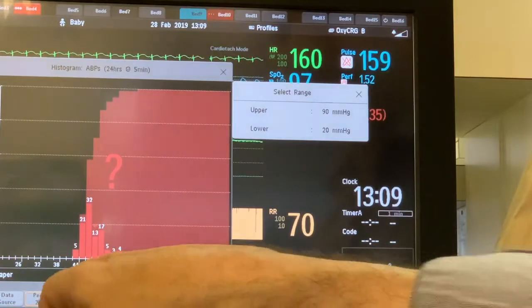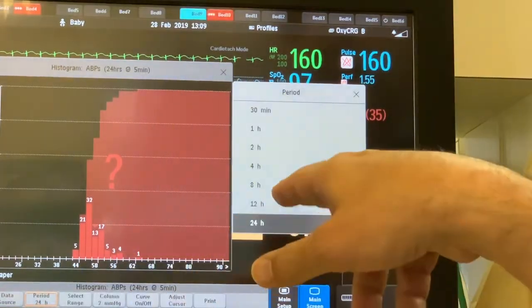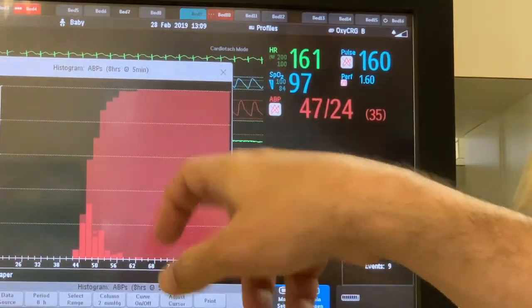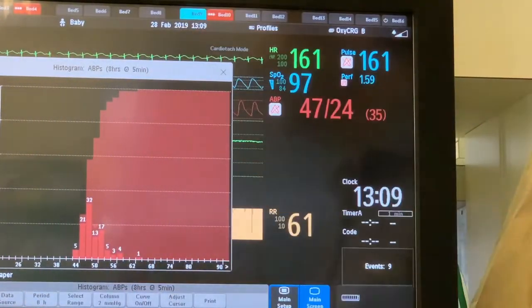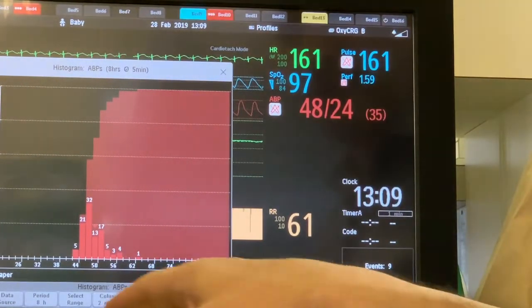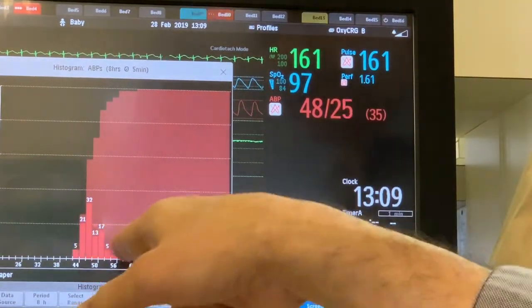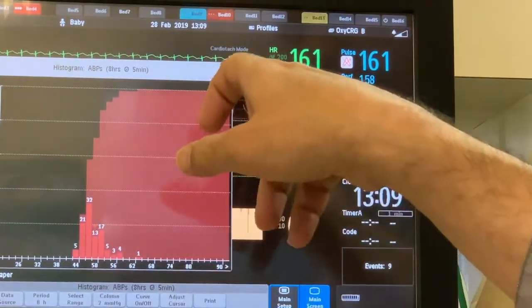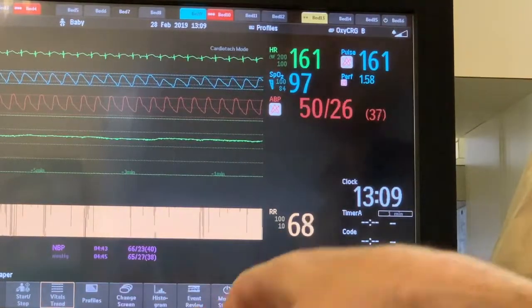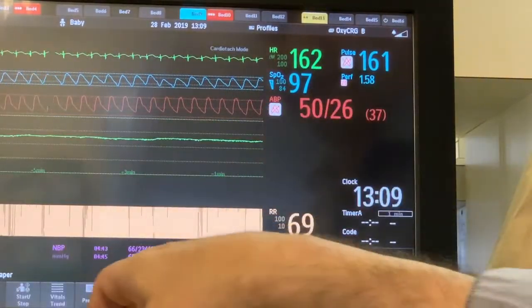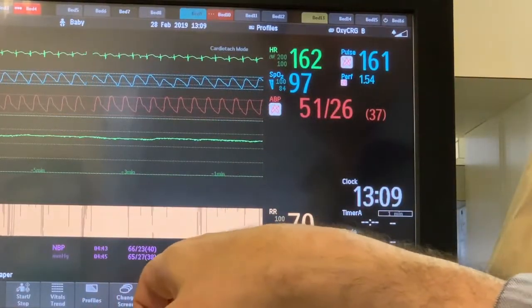If you'd like to change the time interval, you can select 8 hours — for example, if you're not sure about the stability of the infant over the last 8 hours. The systolic is still above 40 mmHg. You can do the same for diastolic blood pressure.